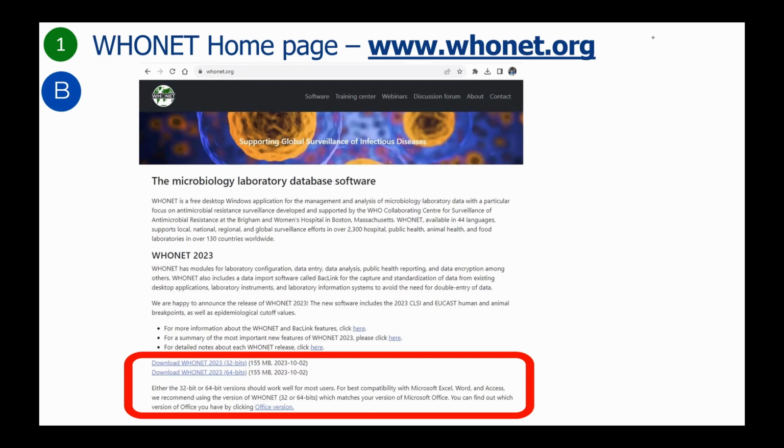Software, which provides links to all of the WHONET software utilities. Training Center, where you will find links for this course and other training materials. Webinars, with recordings and presentations from the WHONET webinar series. The discussion forum, where you can join the WHONET community. In the public area of the website, you can ask questions about the WHONET and BacLink softwares and post announcements about your activities. You can also create private discussion areas for you and network collaborators.